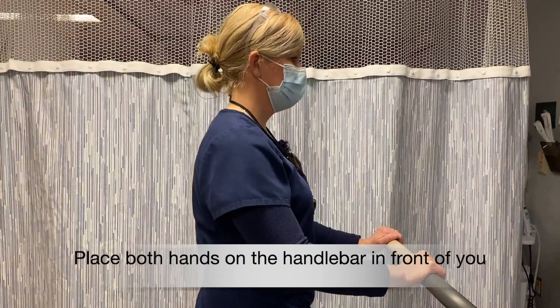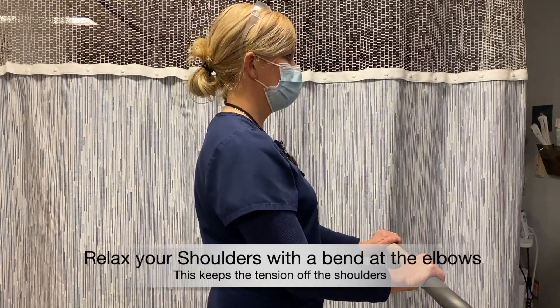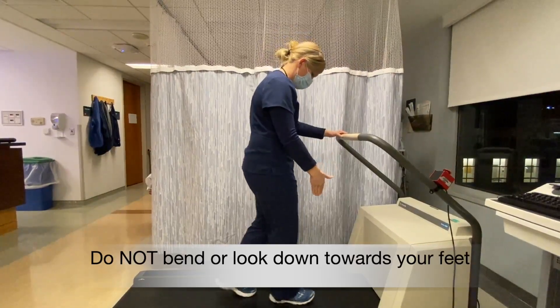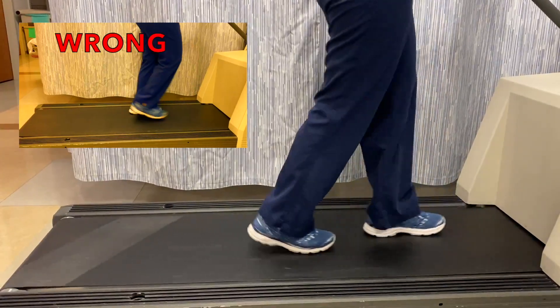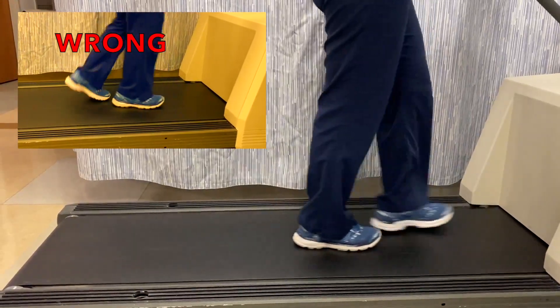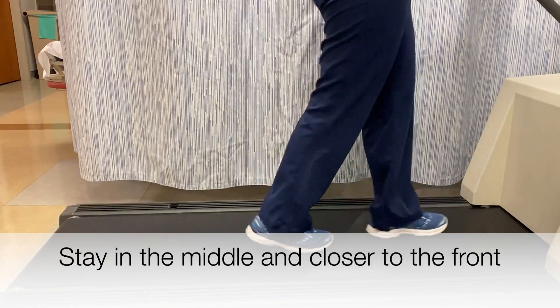Place both hands on the handlebar. Relax your shoulders with a bend at the elbow to keep tension out of the shoulders. Look straight ahead and not down when walking. Walk in a heel toe approach. Stay in the middle of the treadmill and closer to the front of the machine.